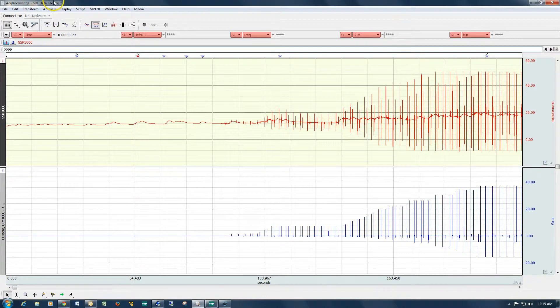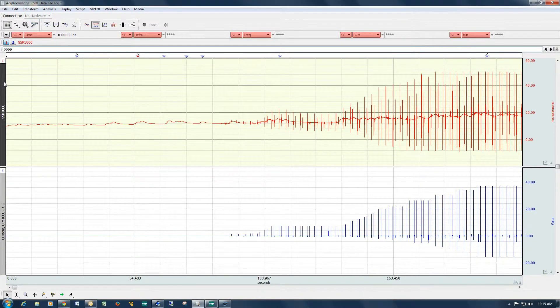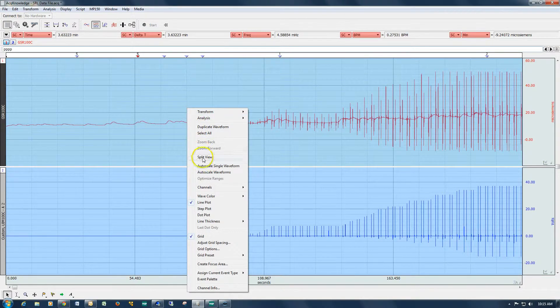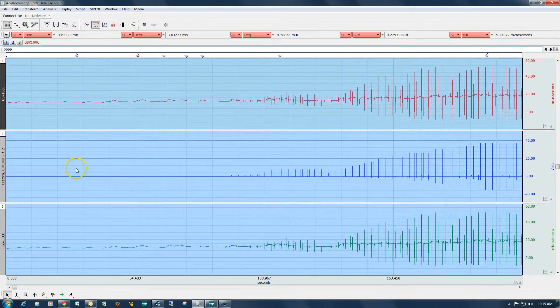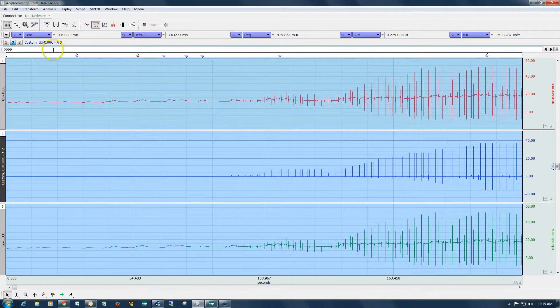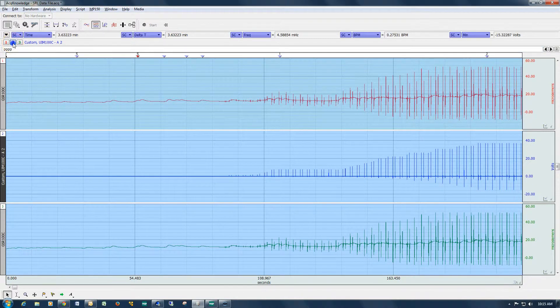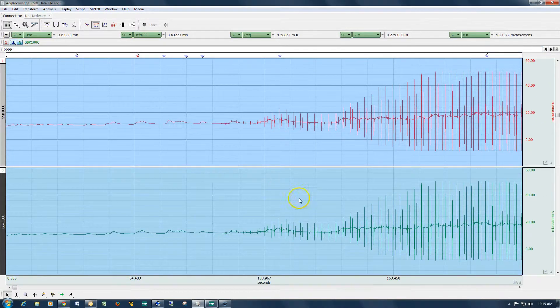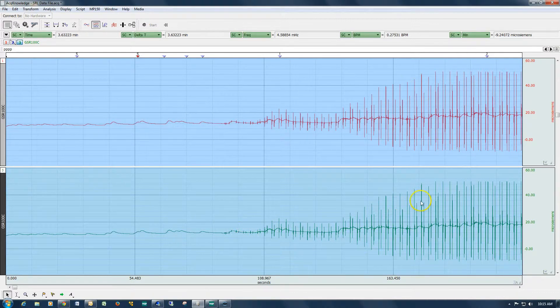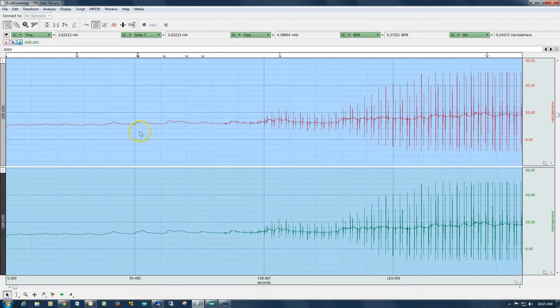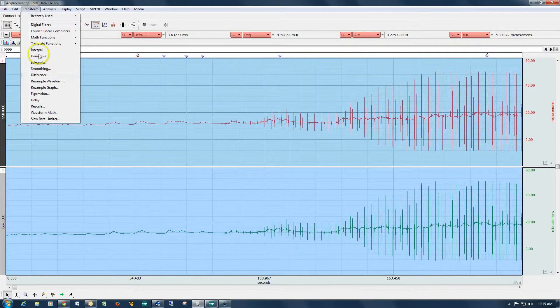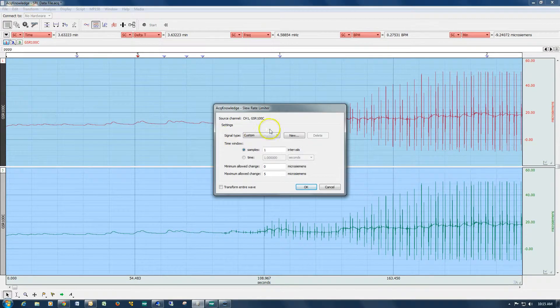Now to do that, you go to the transform menu, and actually before we start, I'm going to duplicate my waveform and I'm going to turn off the stimulation channel. So we've got two identical waveforms, one green, one red, and they're both showing the exact same signal. Now what I'm going to do is go to the transform menu and select slew rate limiter.